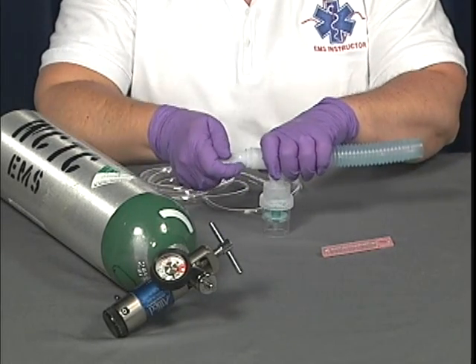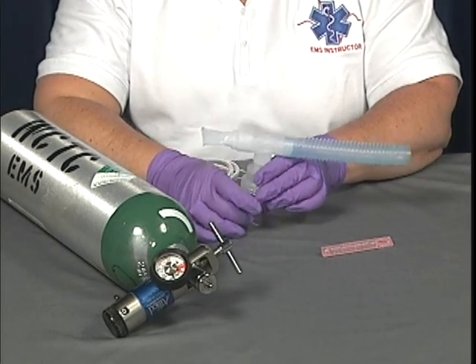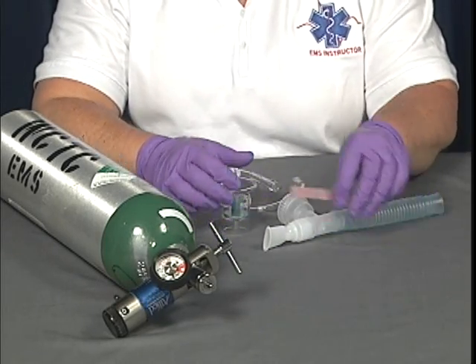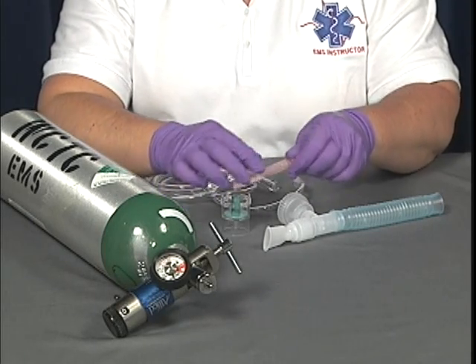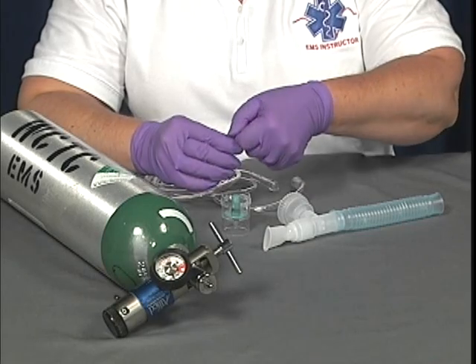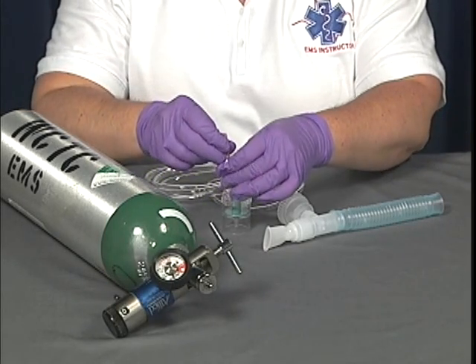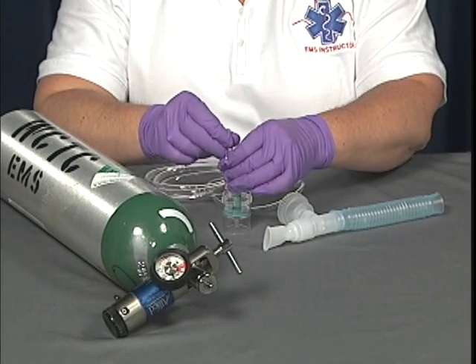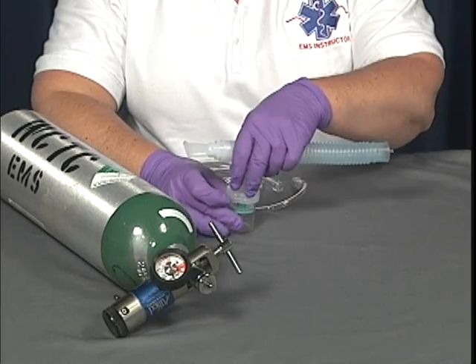Now the top of the medication cup can be unscrewed or the T-piece fitting removed. Double-check the medication expiration date and apply the appropriate medication and dose into the medication cup. Reassemble the top of the medication cup by threading the top on snugly.